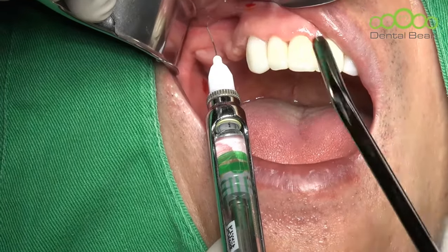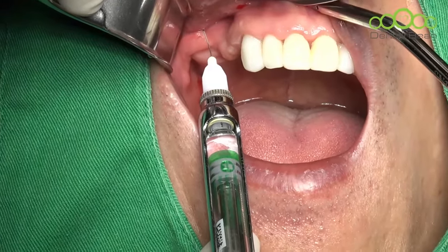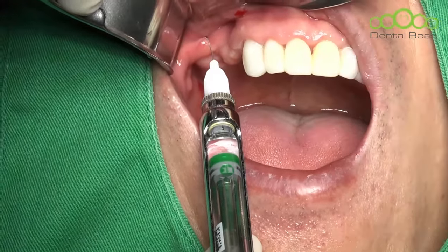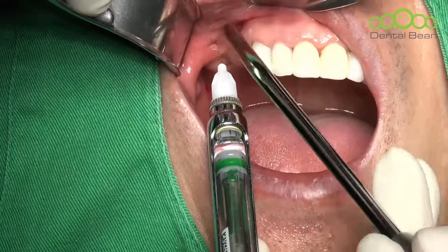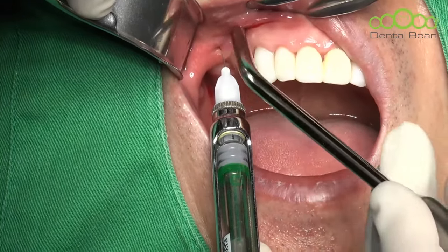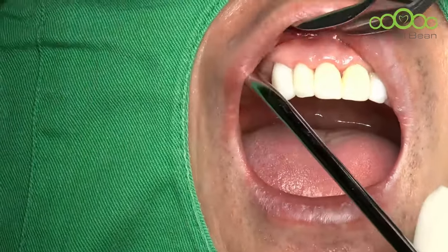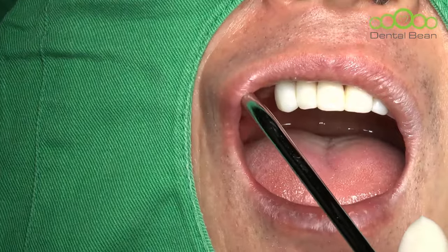He is wearing a temporary denture. So maybe after this surgery, he must continue to use that denture. So I'm planning a submerged implant in such a case.